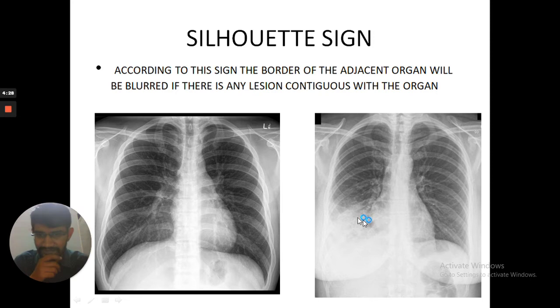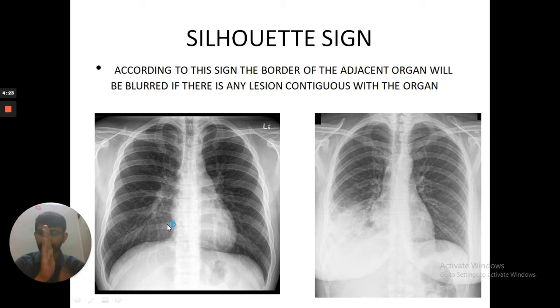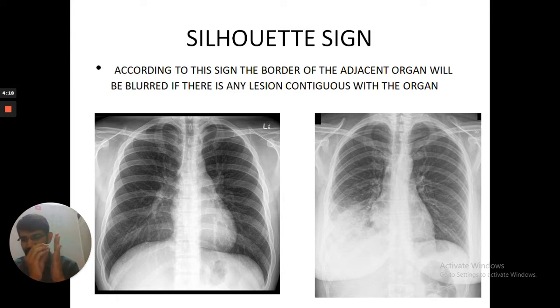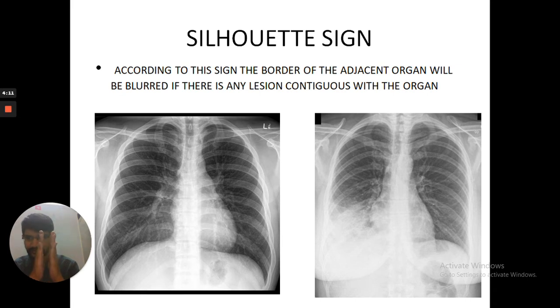On the chest X-ray on the left side, you can see the cardiac and the lung side by side. This is your right lung and this is your cardiac. If there is any lesion in the right mid-lobe, then the cardiac border will appear blurred. When the cardiac and lung are contiguous, if there is any lesion in the lung, the cardiac border will appear blurred.